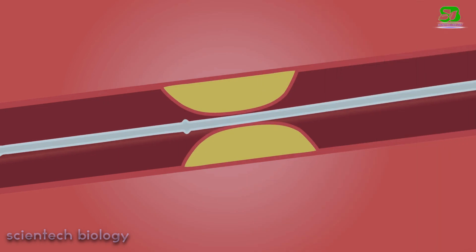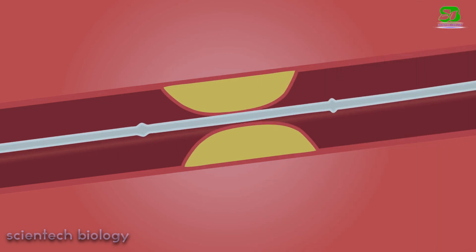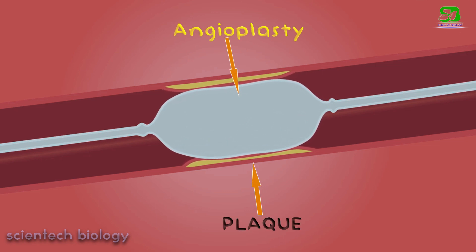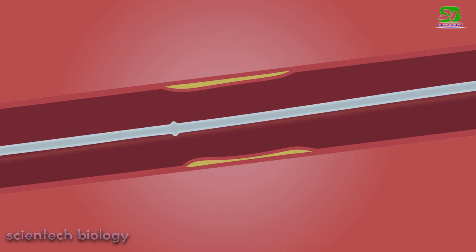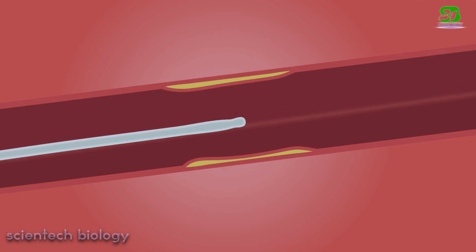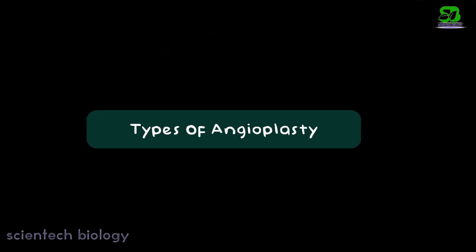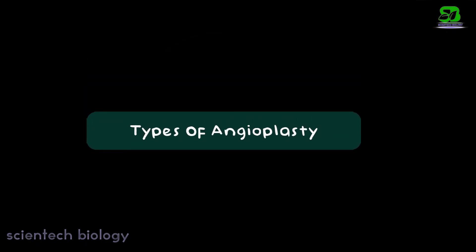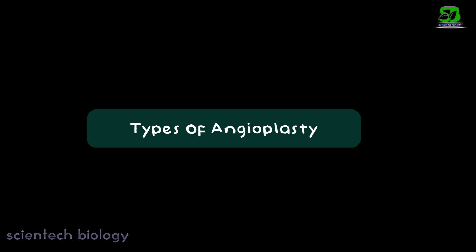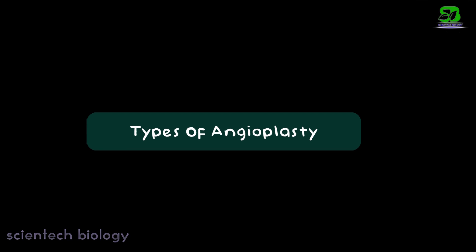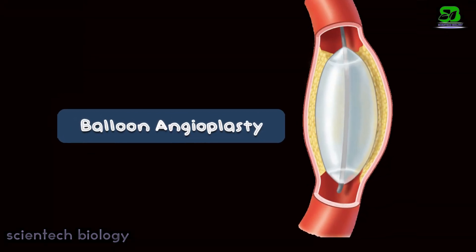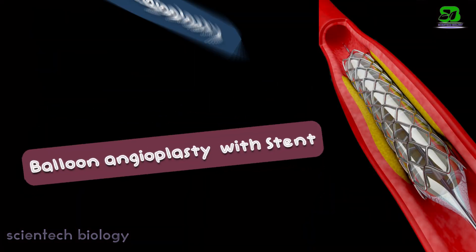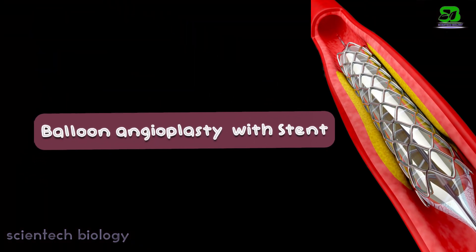To open the blockage or to remove the fatty cholesterol plaque from the coronary artery, angioplasty is used. The cardiologist suggests three types of angioplasty on the basis of location and shape of the blockage or plaque in the heart: balloon angioplasty, balloon angioplasty with stent insertion, and laser angioplasty.